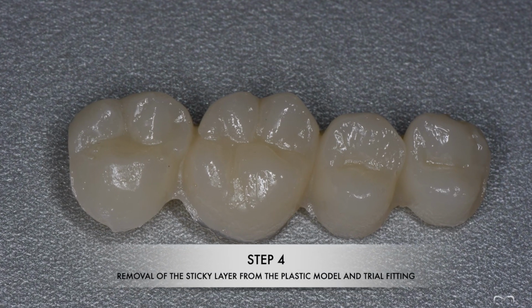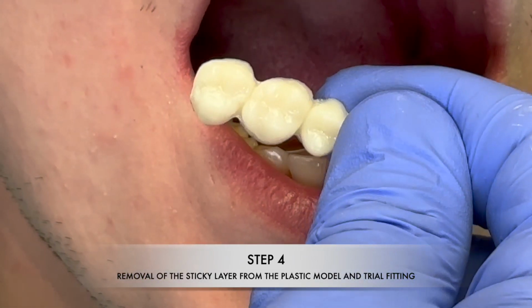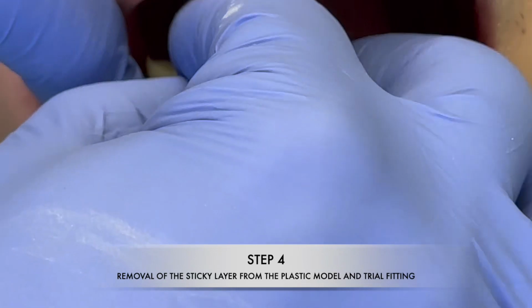Step 4. When curing fast hardening plastic, a sticky layer forms on its surface, which we remove with alcohol. Then, we check the position of the model on the teeth of the lower jaw.